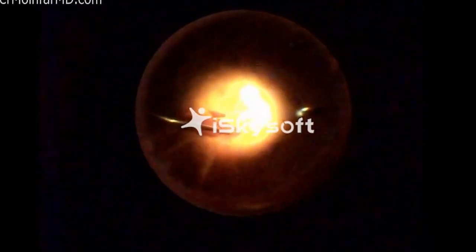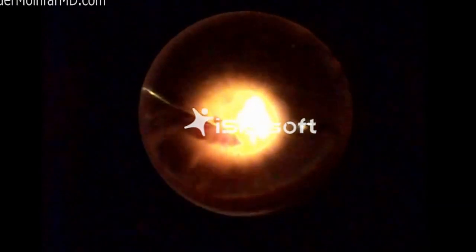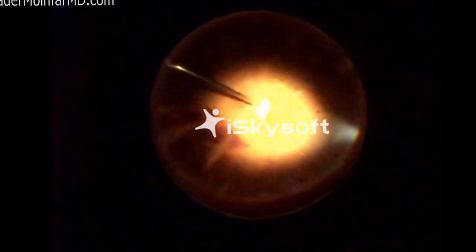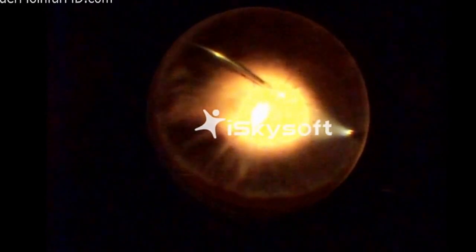And so what I'm doing here is now trying to create what's called a posterior vitreous detachment. You may read on my website, we've talked about a PVD, or a posterior vitreous detachment, as a frequent cause of flashes and floaters. Most diabetics at this stage do not have a PVD, and it's very important that one be mechanically induced by the surgeon. Failure to do so is a frequent cause of rebleeding after surgery and or persistent or recurrent retinal detachment, and it can be very tenacious and somewhat challenging in diabetics, but with experience and some good luck it usually is feasible.